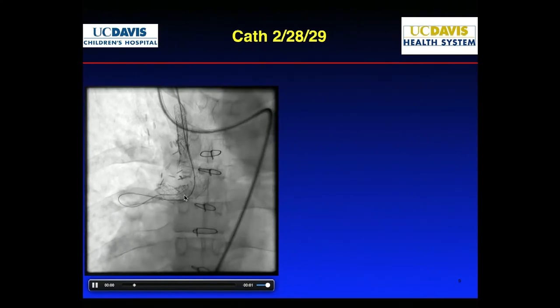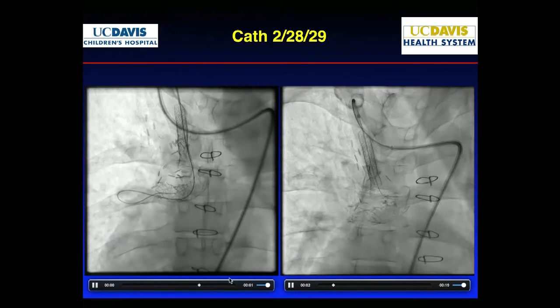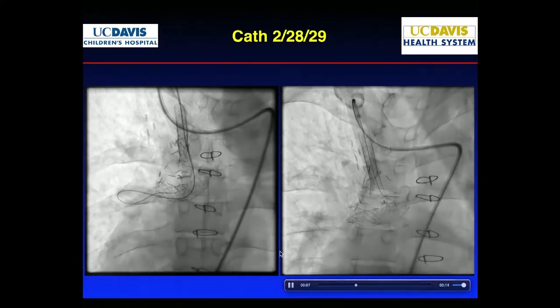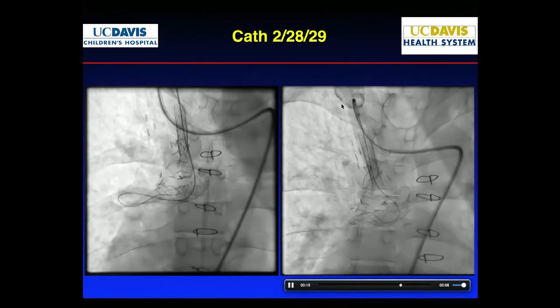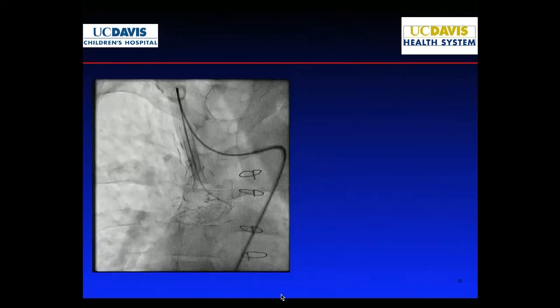Of course, with the straighter wire, the stiffer wire, it straightens a little bit. Now, at this point, I can't tell whether I went through the end of the stent or through the side, but I said, it doesn't matter. Even if I go through the side, I'll take the side. So here we are. Now, this is another 4 or 5 hours into this procedure as we're trying to figure out how to gain access into this. So you see how we had the wire, and as we run a stiffer system in, everything buckles every time. It will either buckle in this region or it'll buckle in this region, and we just could not get a good stiff wire and the sheath in that position.